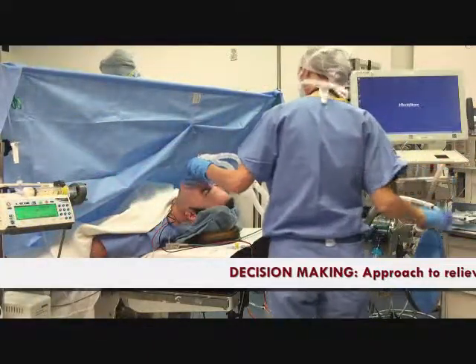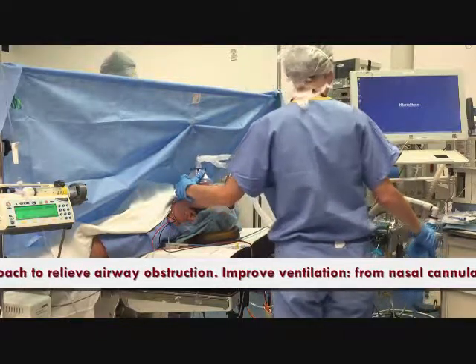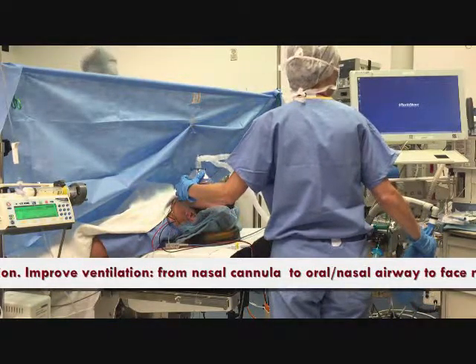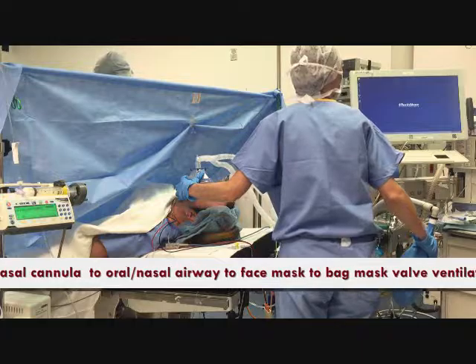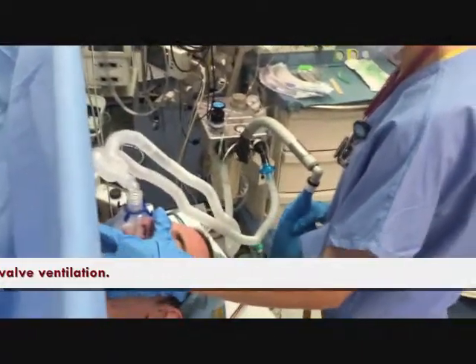The most important decision making in this scenario is by approaching to relieve airway obstruction and improve ventilation, from nasal cannula to the use of oral or nasal airway, to face mask, and to bag mask ventilation.